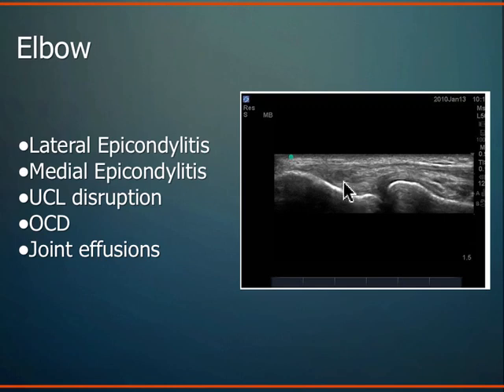And again, you can direct injection treatments in other modalities, new modalities like platelet-rich plasma and some of these things you guys have probably heard about. And you can use the ultrasound guidance very well for that. Again, ligamentous disruption, ulnar collateral ligament on the inside of the elbow.